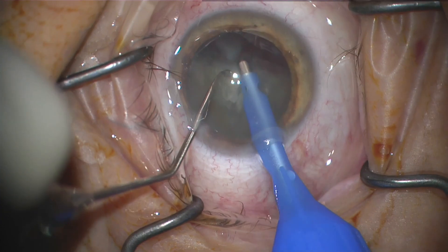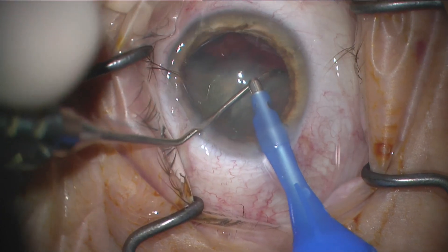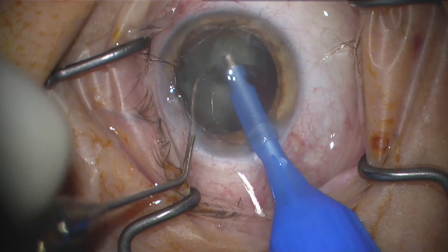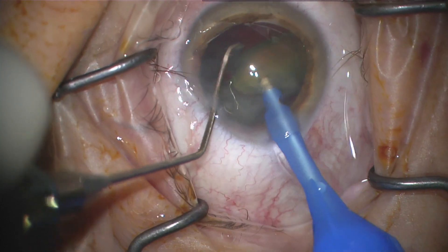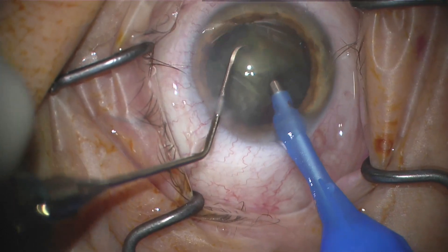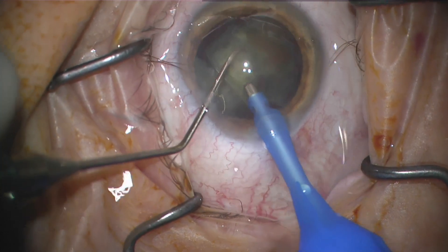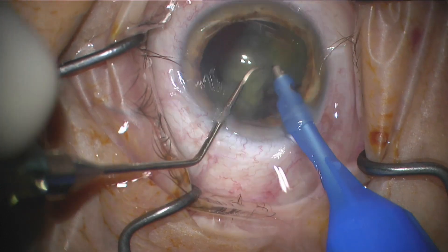Throughout this whole process my finger is on the throttle and I'm pushing on it to give it the right amount of cutting and aspiration. It's kind of slow going because I'm being conservative and it's a thick lens — this device is not quite made for really thick lenses yet. The tip is really round, so it's kind of hard to break through with this tip.